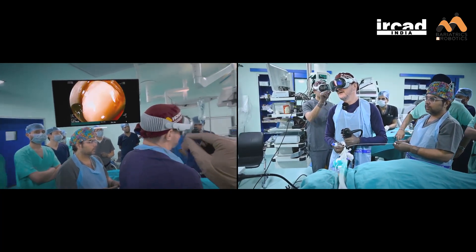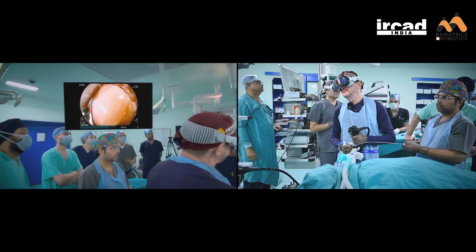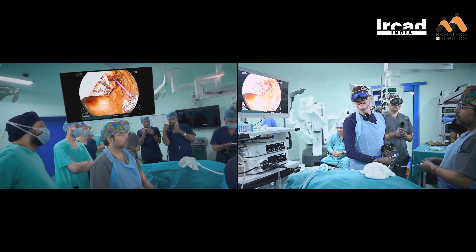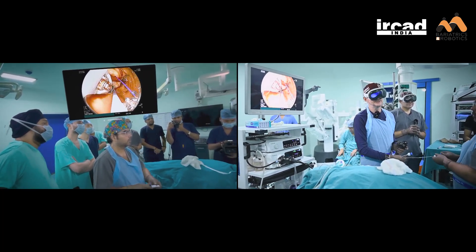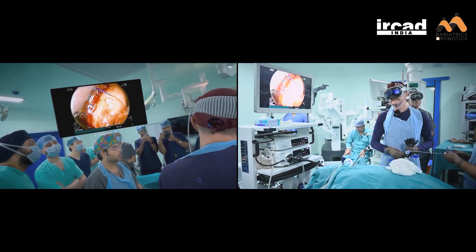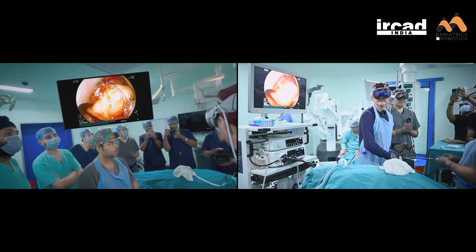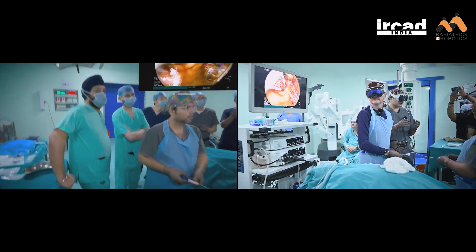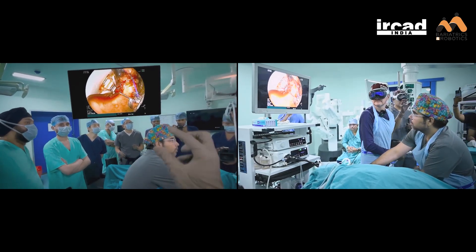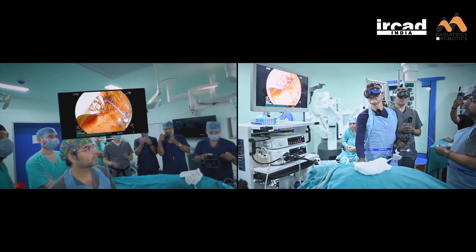It takes a very minimal amount of time — less than seconds — to move your screen. We were experimenting, and we're not going to need to use the external screens anymore. It's very surprising to me how intuitive it is. In fact, this will be more useful for people who are doing EMR and ESDs. They need larger screens because the vision is one of the best you can get, plus the ease of positioning the screen wherever you want to.